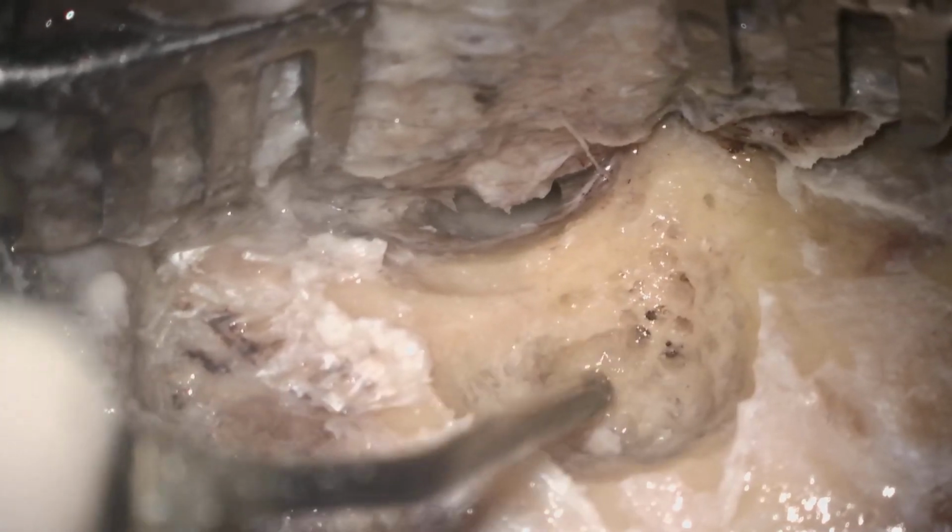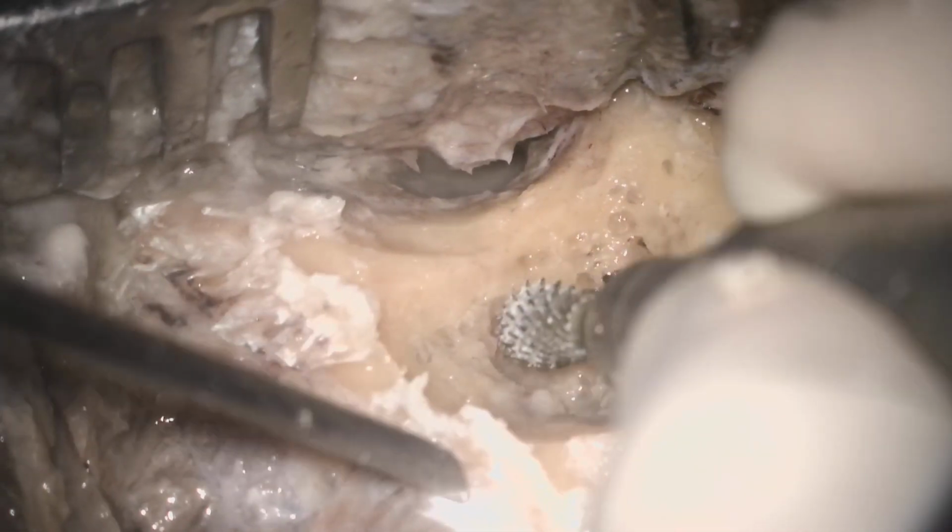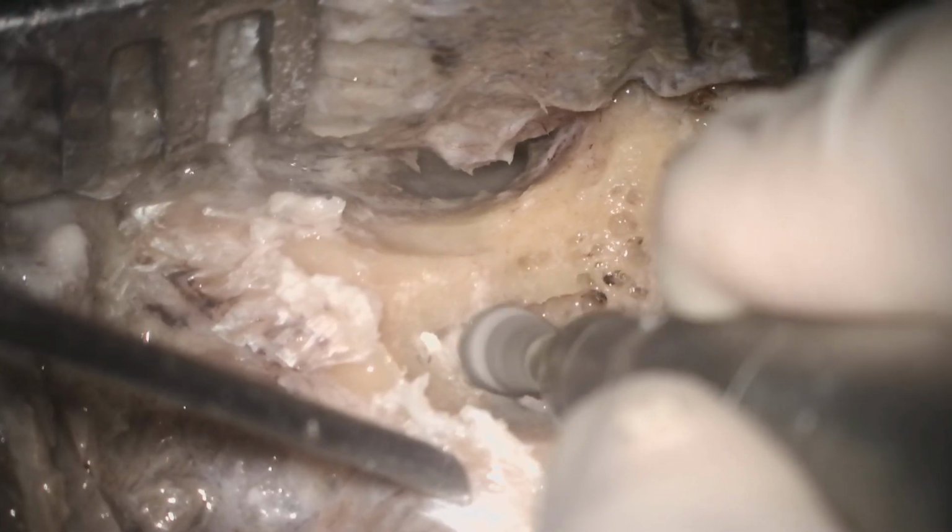So when you are drilling, there will be constant irrigation from your saline set, and intermittently when there is some accumulation of bone dust, you will give some copious irrigation to remove all the dirt, all the bone dust over the dissection area. So that will actually clear the field and increase the visibility of the area.